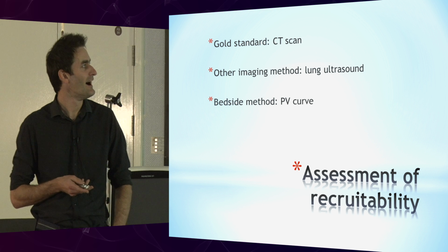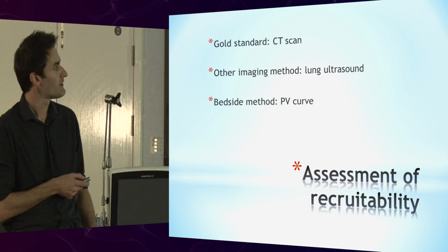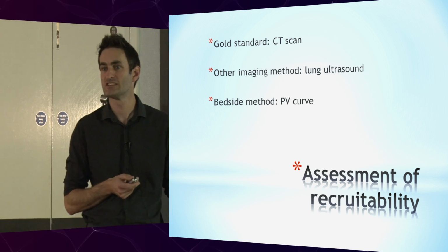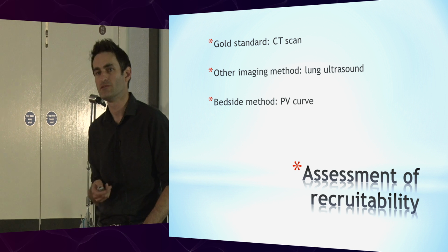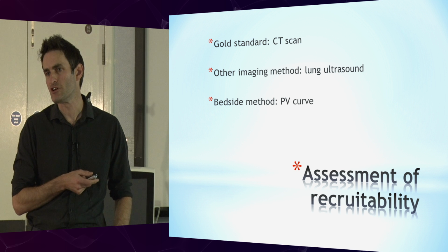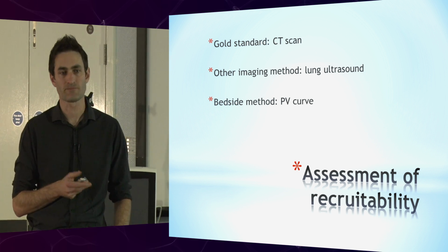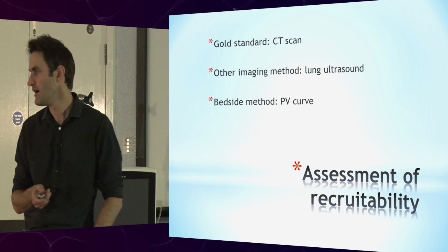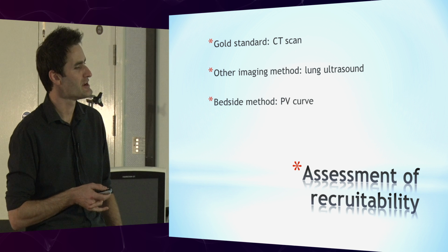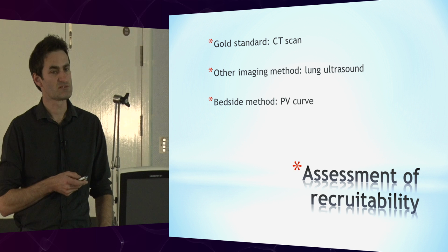Probably not. Used experimentally mainly. Lung ultrasound is something that's being increasingly used, and I'm sure many of you have seen this done. Some degree of interpersonal variability or reproducibility is difficult. So there is variation between operators. So what other ways can we do this slightly more reliably?